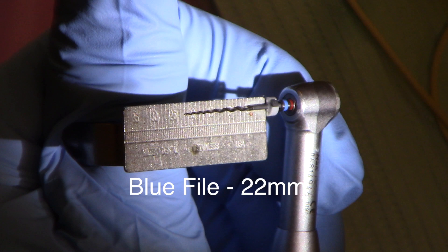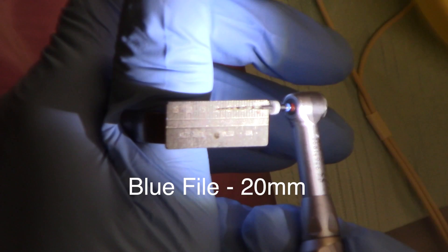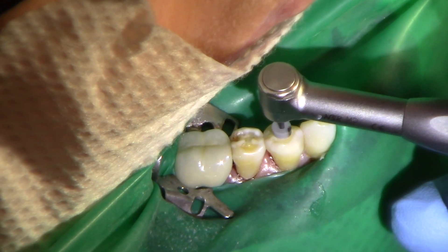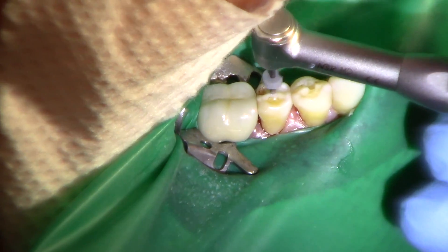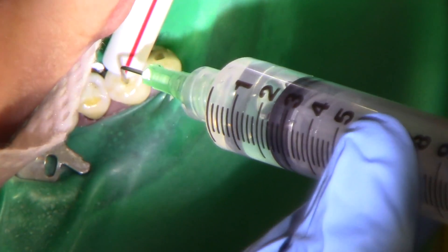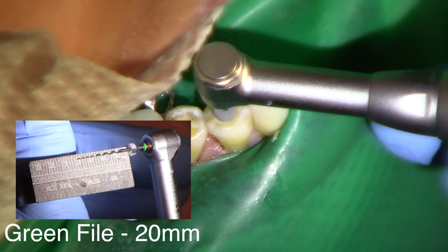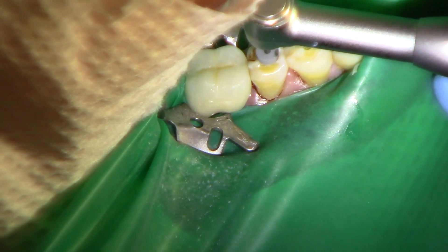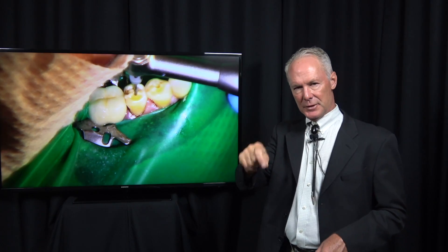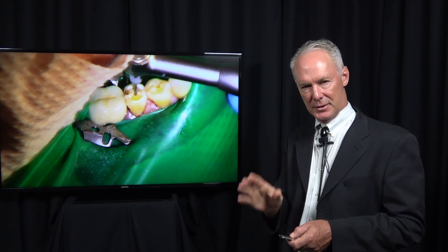Now I'm coming back with the blue file, which is a 30 — a little bit larger than the red 25. Fill these orifices up with the sodium hypochlorite. Be sure it's really lubricated; don't file a dry canal. Now the green file, which is a 35. Light pressure and then pull it up. Three to five penetrations is all you do with each file. If you use 10 or 20 ups and downs, you might fatigue the file and it could separate.